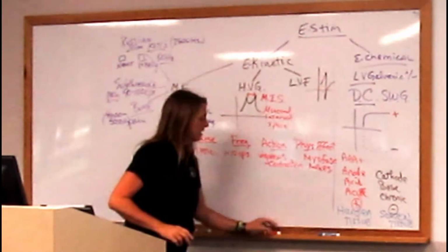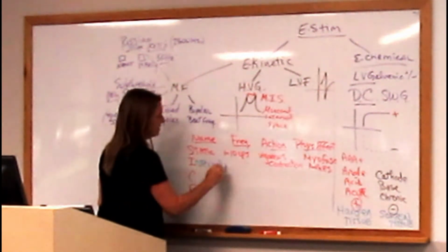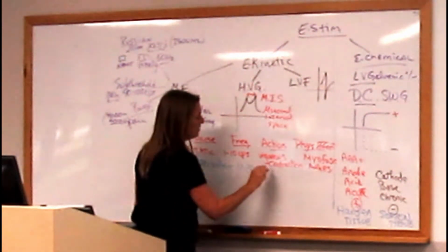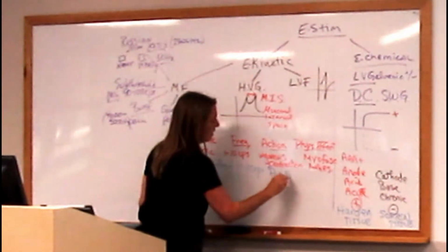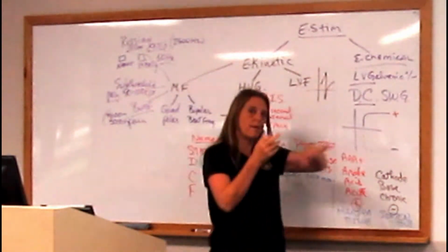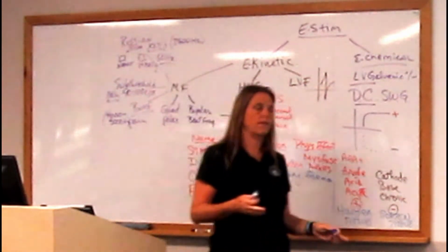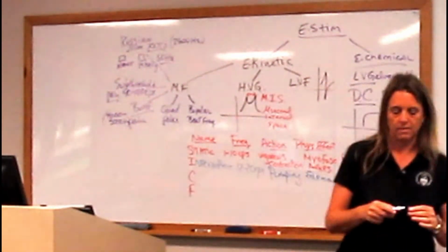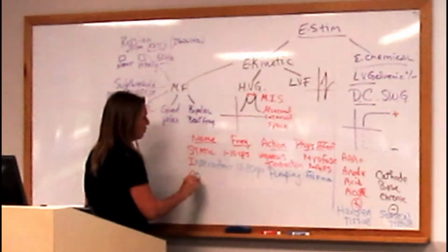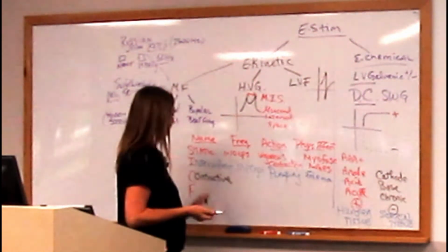The next thing is going to be the intermittent. An intermittent setting is going to be something we're going to use at 12 to 20 cycles per second. And this one's known for doing a pumping effect to get rid of edema. So this is the one that we can use in a subacute phase to help pump out the edema. Static is going to be used, of course, in a chronic phase because myofascial adhesions tend to be something that's been around there for a while. They're adhesions.